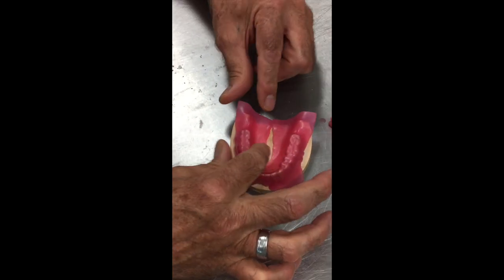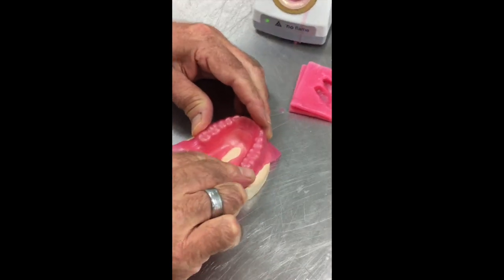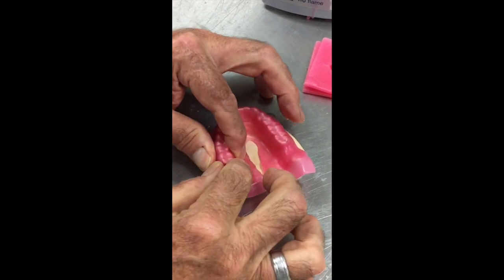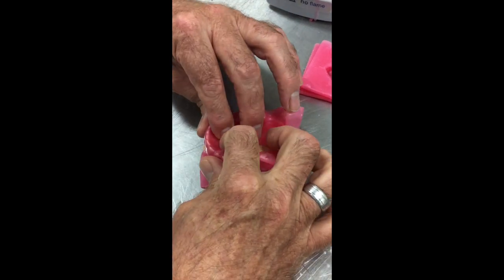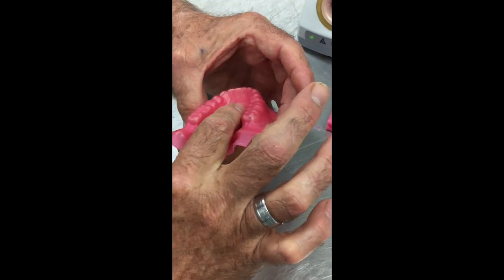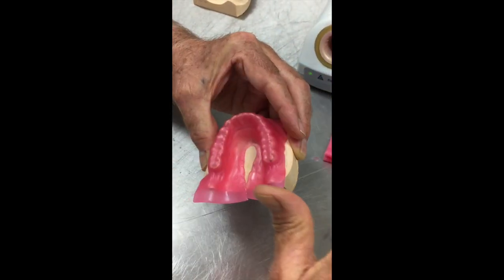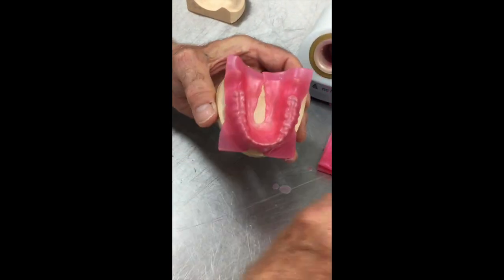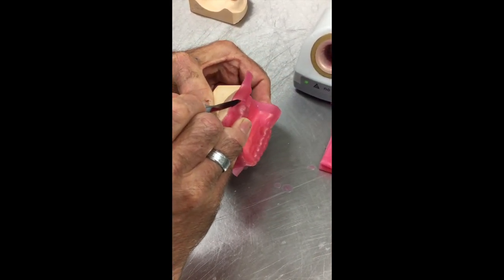So you can see how we've adapted that, and particularly pay attention to adapting it around the back of the last tooth in the arch, so that we can capture that whole surface. And particularly if your crown prep is on the last one, of course, we need that tray to wrap right over that area. Okay, so now it's adapted to the line. We can see the line clearly all the way around. It's not flared out so that your tray flares out at the edge. It's adapted right to the line all the way around. We're then going to take a hot instrument, just lightly hot, and cut it to that line all the way around.